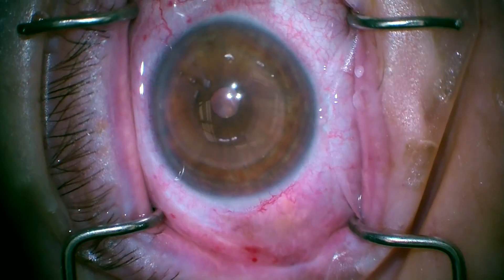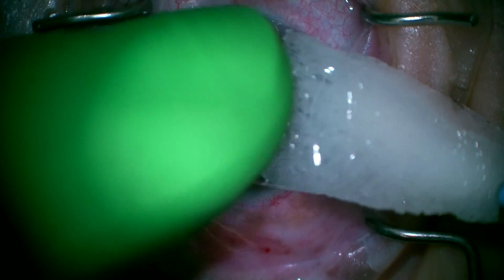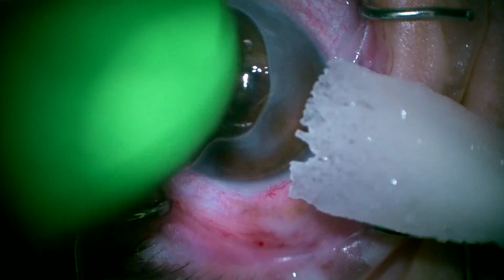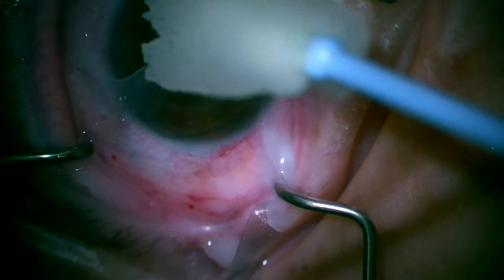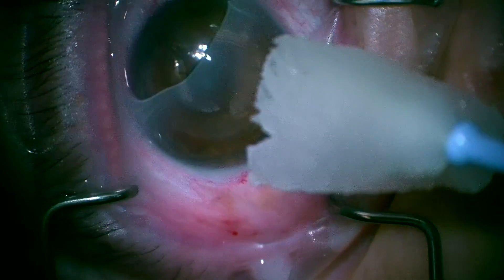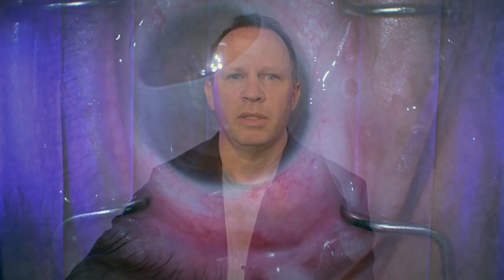I can't believe how quick this surgery was, how comfortable it was for the patient, and what a fantastic use of technology. All in all this entire procedure took somewhere around 15 to 20 minutes, done under topical anesthesia — a much more comfortable and much safer procedure than any open-sky procedure I've ever done. All there is to do now is put some drops on the eye and a bandaged contact lens, and the surgery is essentially finished. Once again, I'm Brandon Ayers from the Corneal Service at Will's Eye and Ophthalmic Partners of Pennsylvania — I hope you found this video interesting and can apply it to your own patients.